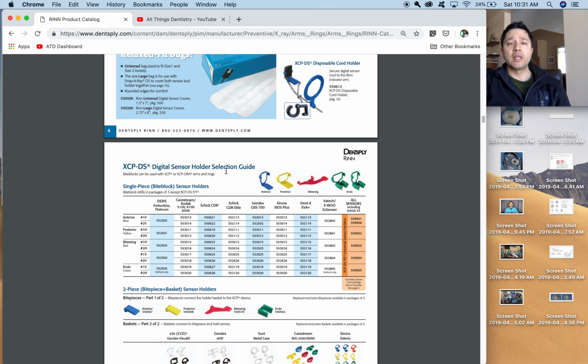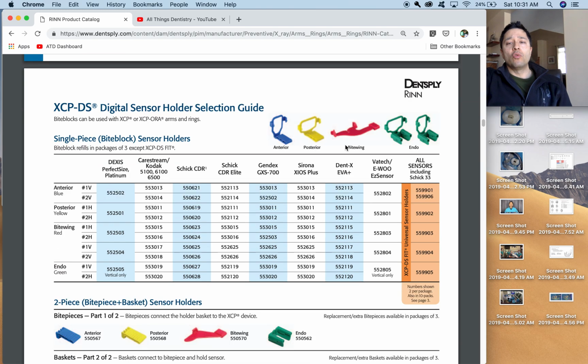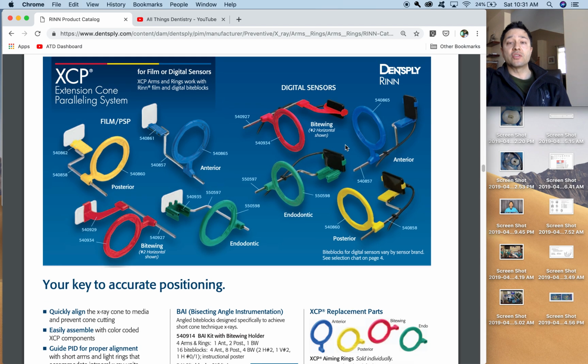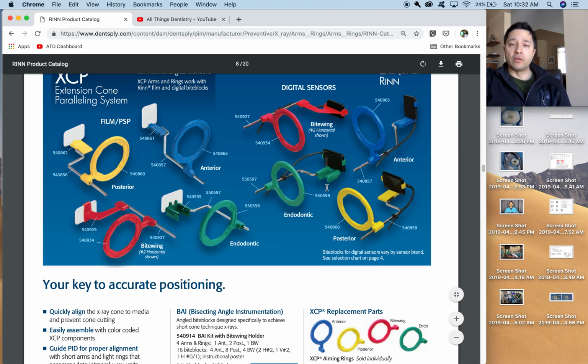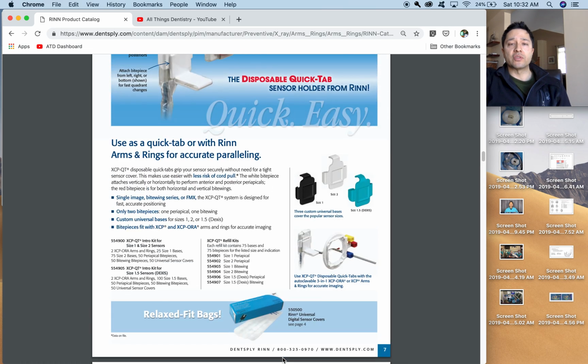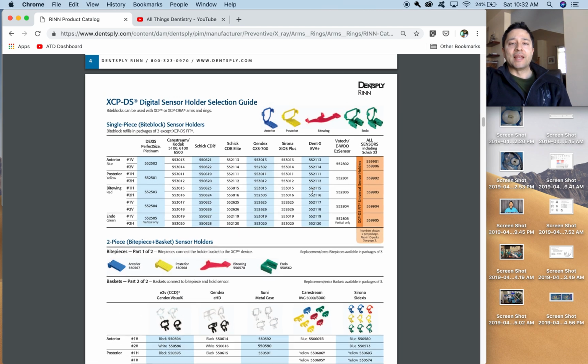So let's just scroll in here, and okay, let's talk about the direct sensor, and this is it here. This is the metal piece and the ring, and these are generic. The thing that's not generic for direct sensors is the little basket. So you would have to go back up to this other table. You purchase those two pieces there, and then go up to this table right here.